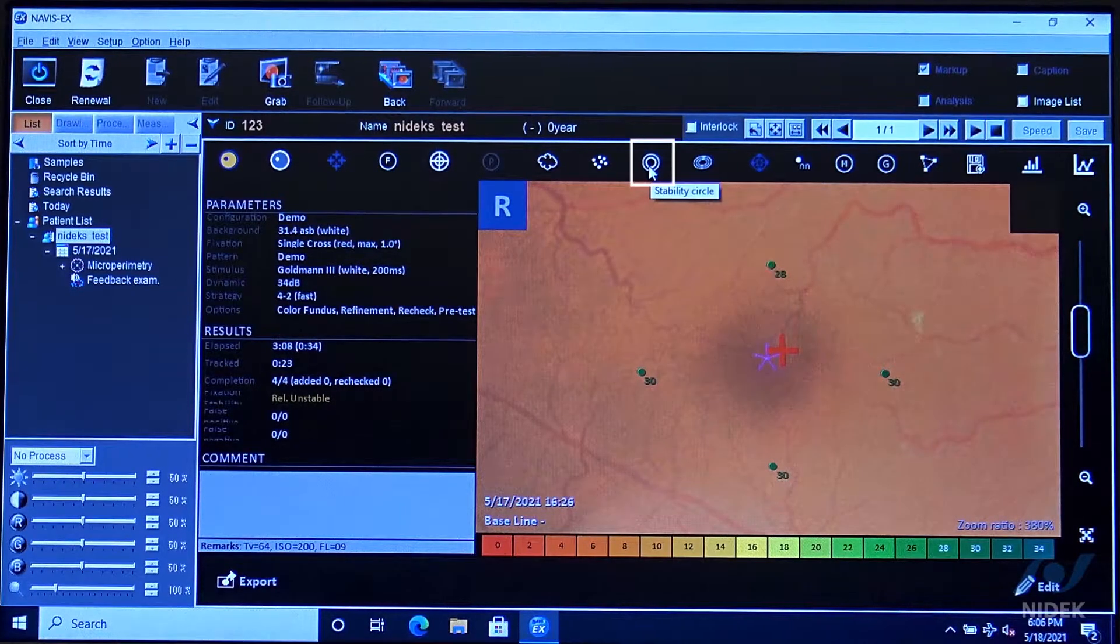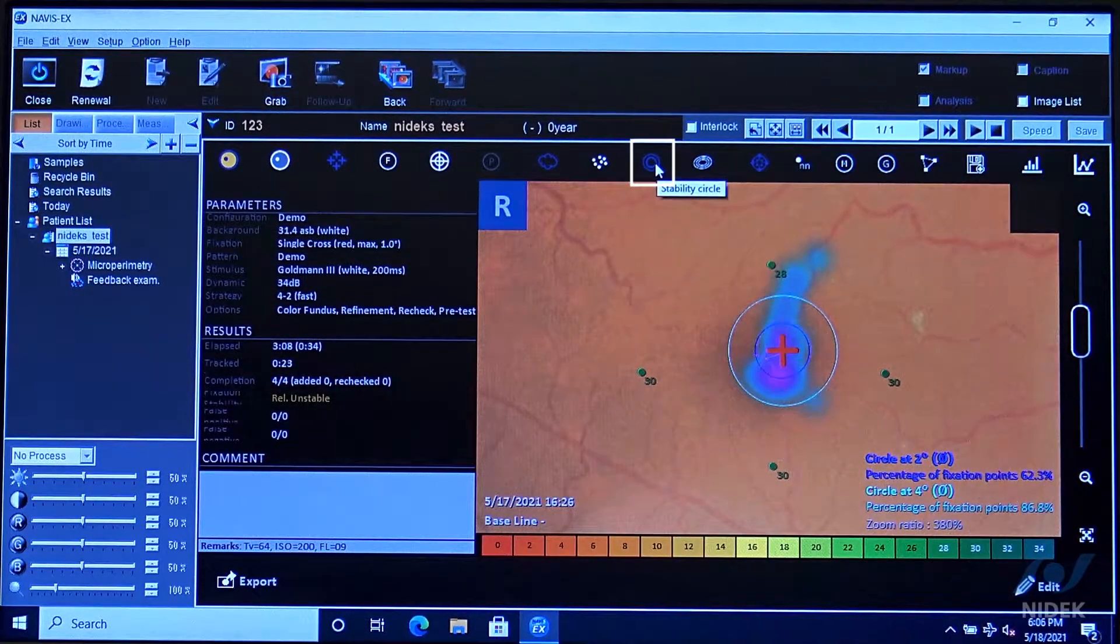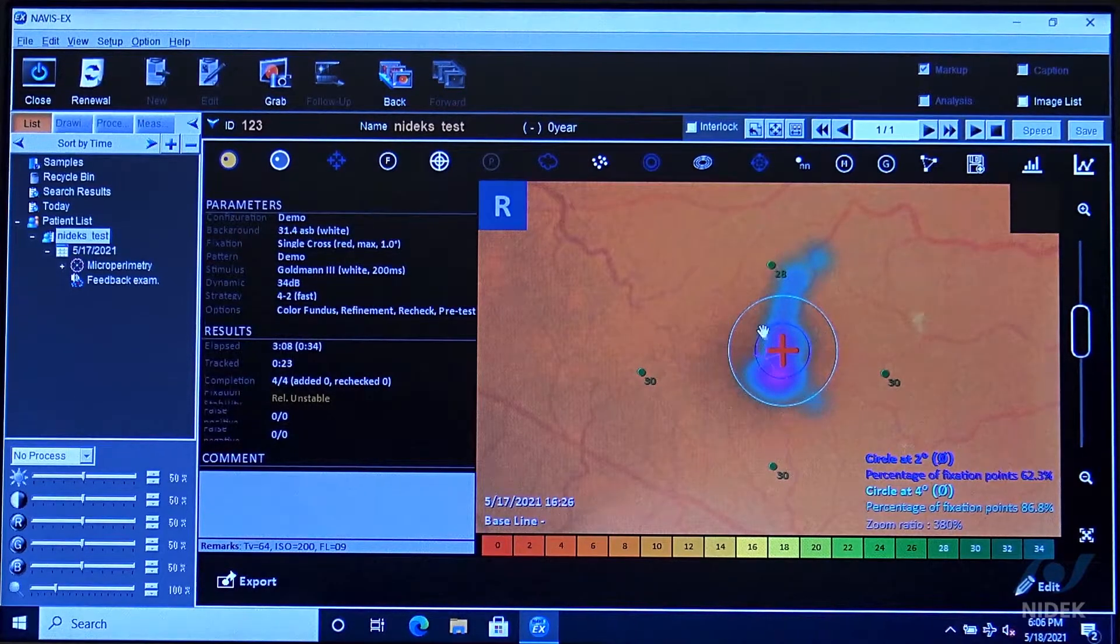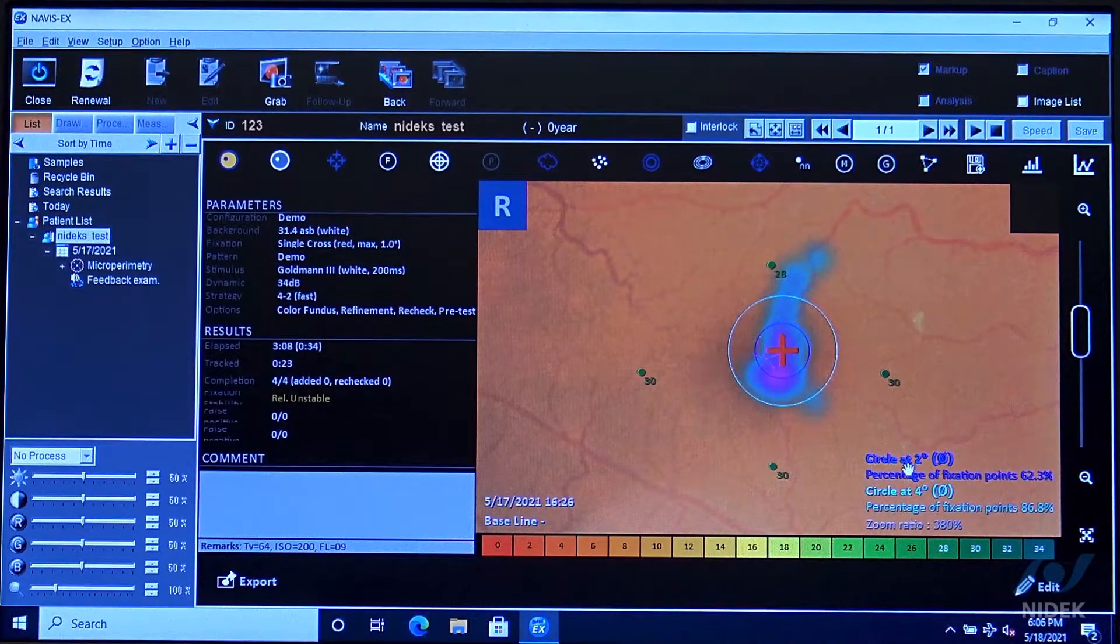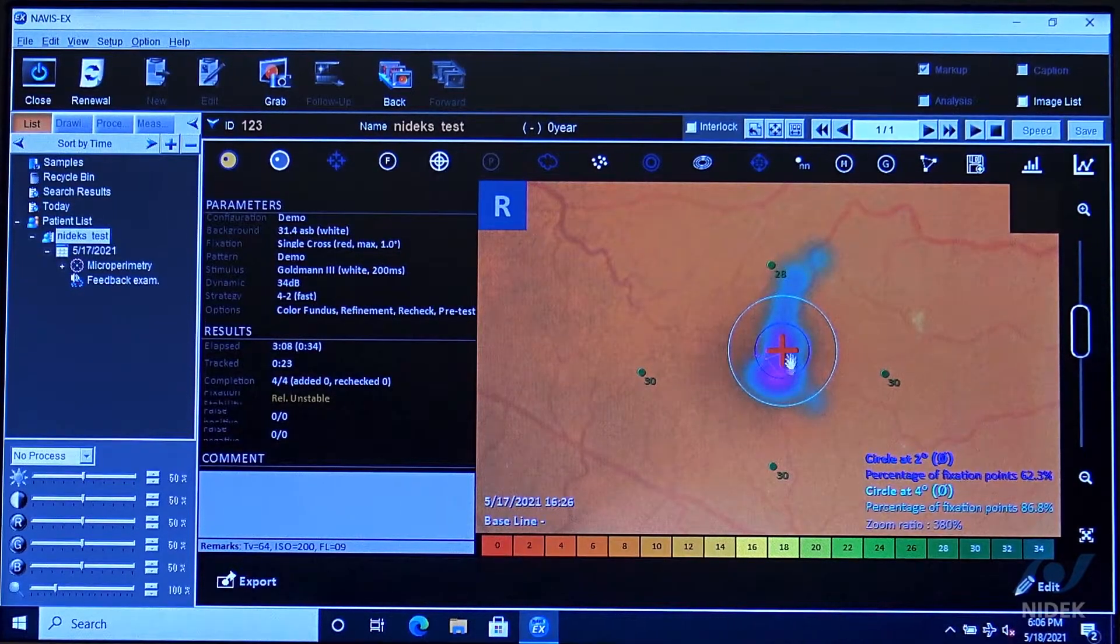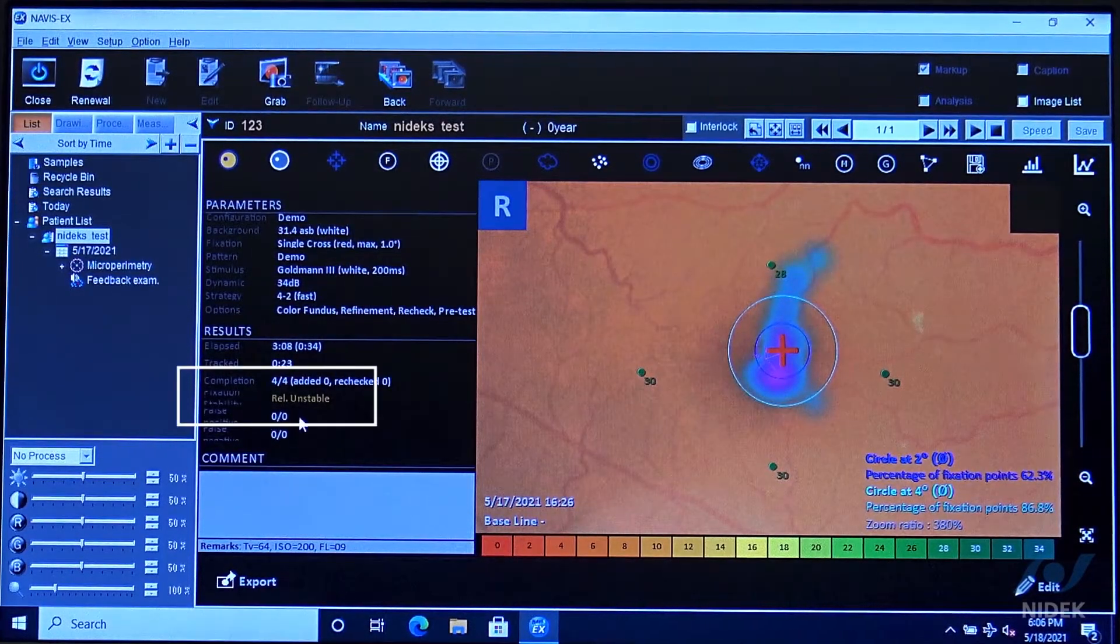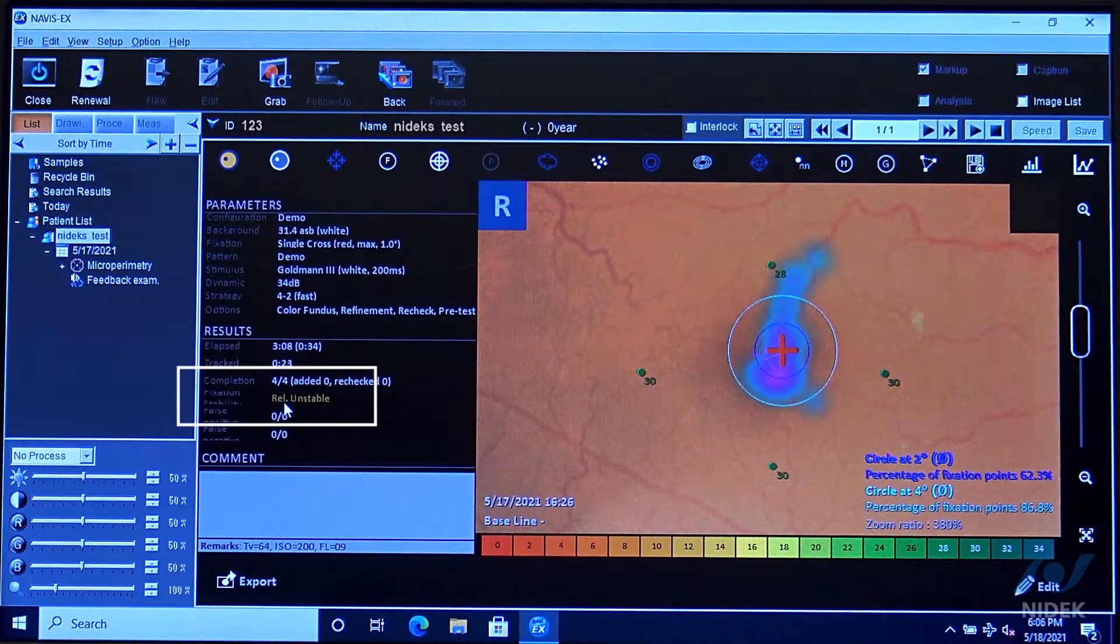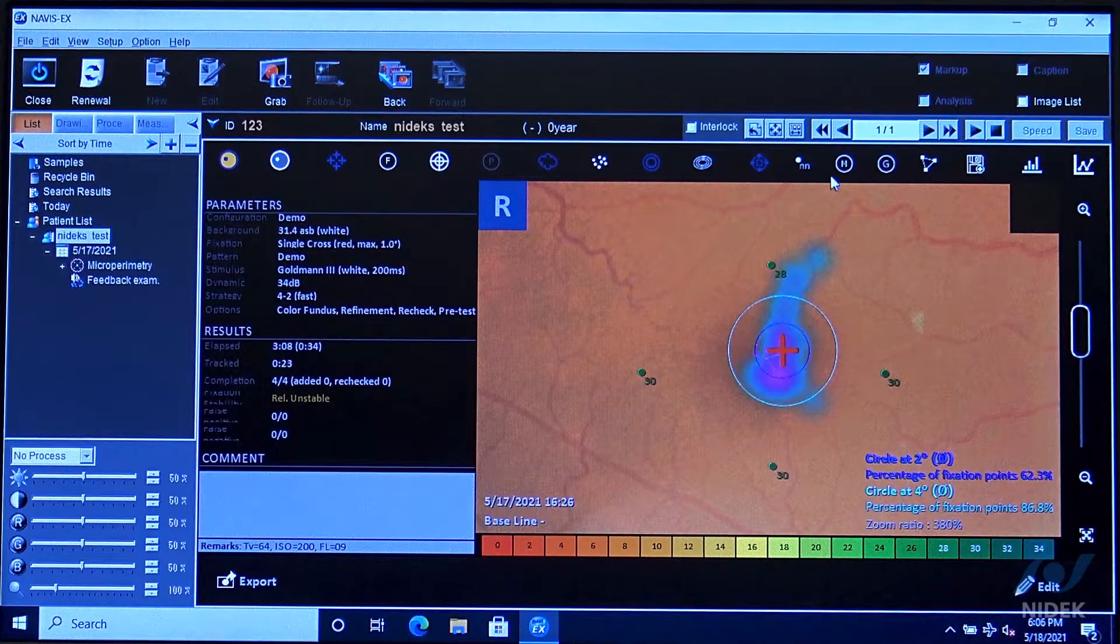We also have our fixation analysis and stability, a two degree and four degree circle. It's going to give us the percentage of the patient's fixation within a two to four degree circle, and it's going to tell us whether it's stable, unstable, or relatively unstable as we see here.